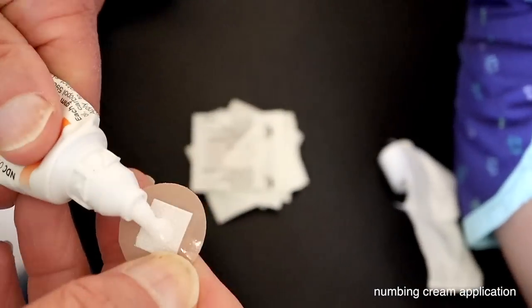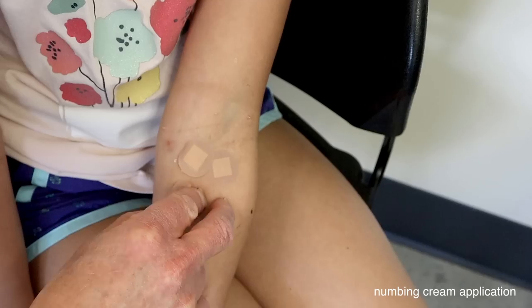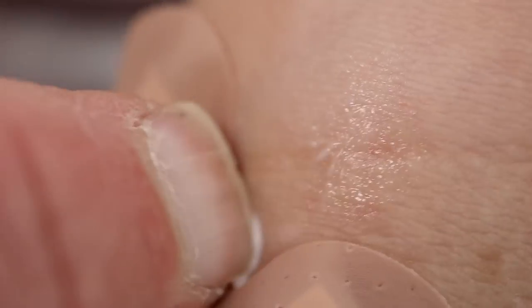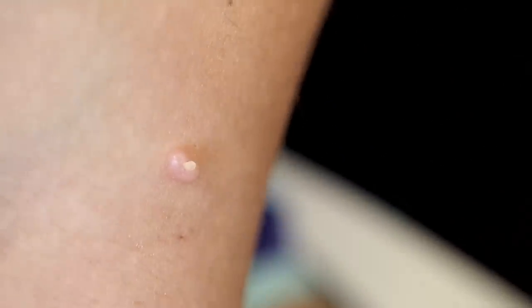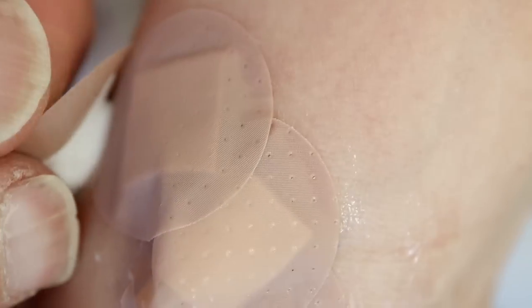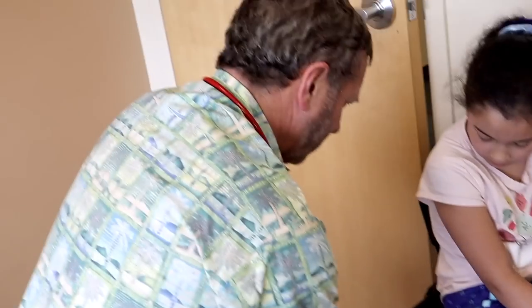Put a little dab of that. Another one right there. You get the record number of band-aids. Now generally with warts, one of the cool things is you don't have to necessarily freeze every last one. So 15-20 minutes and we'll freeze.